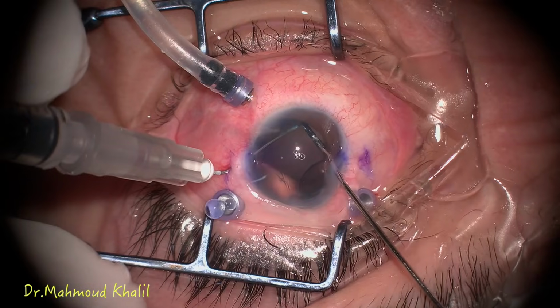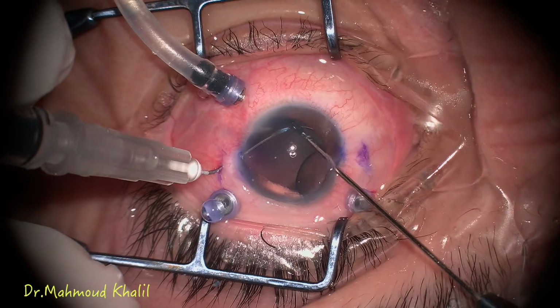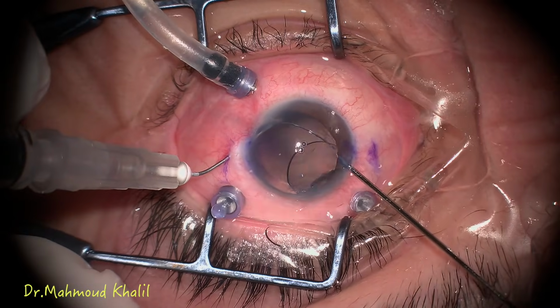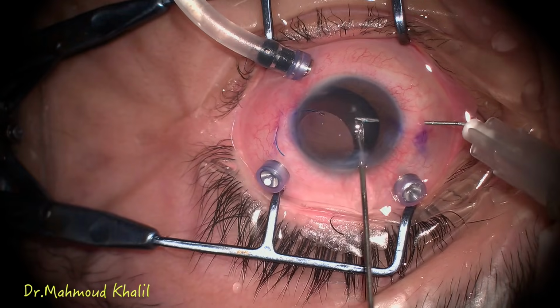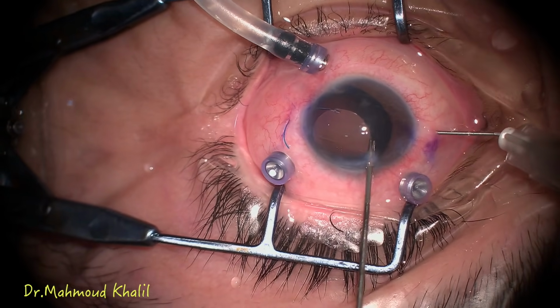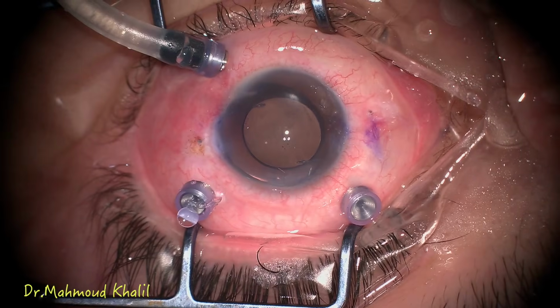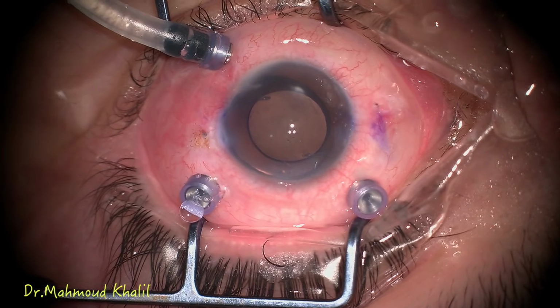If the iris is severely traumatized, then a scleral fixated IOL using a Yamane technique is the proper choice. Fixing the first haptic and then going for fixation of the second haptic. Going outside until centering of the IOL.